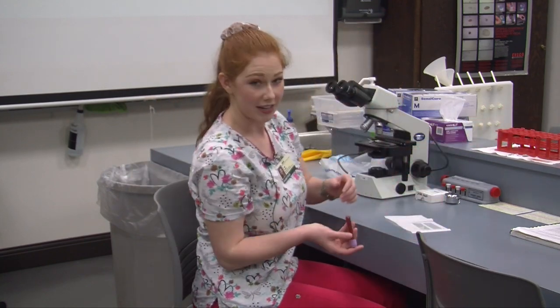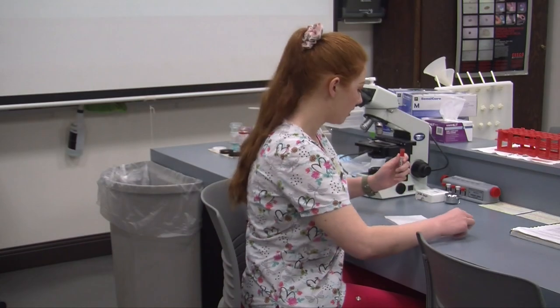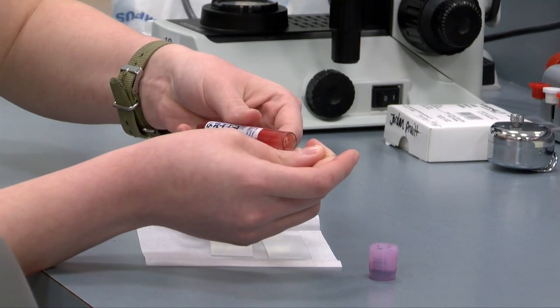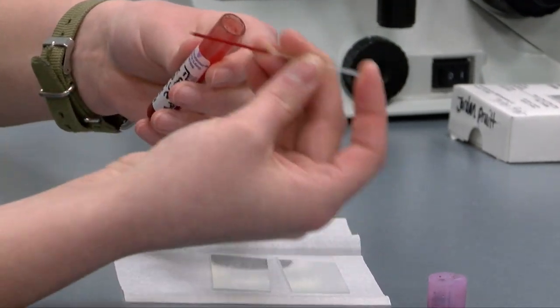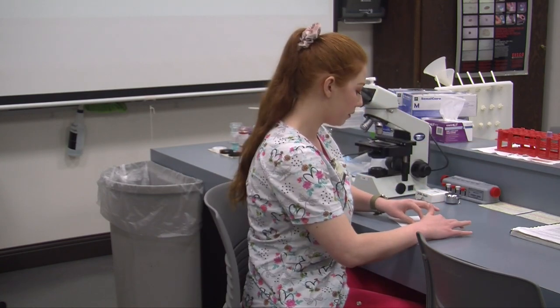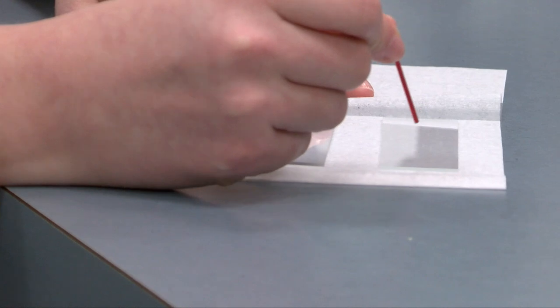First I'm going to invert my blood eight times to make sure that it is well mixed. I'm going to go ahead and drop a little bit of blood here in my crit tube. Once I think I have enough to make a smear I'll stop filling it. When I'm making my smear I want to have about a 30 to 40 degree angle. I'm going to slowly draw back and then push forward.